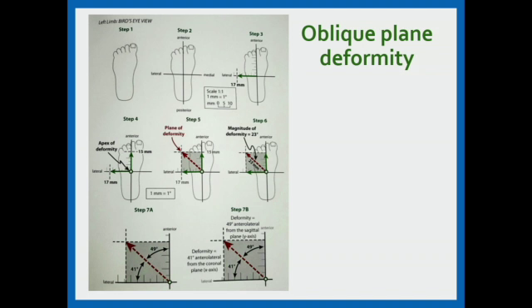So for example, if this patient has 17 degrees of deformity and 15 degrees of deformity, then you just convert them into millimeters and plot it on this line. You take the slope of that graph and you measure that distance. So that is 23 millimeters.